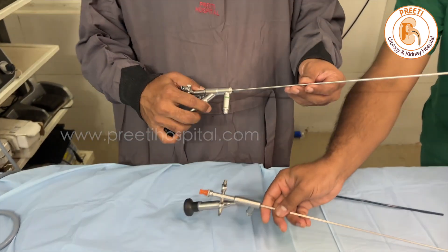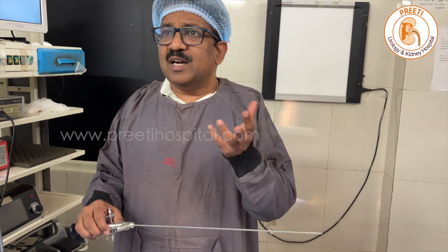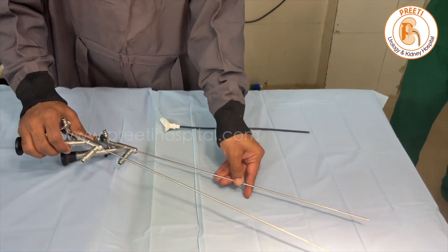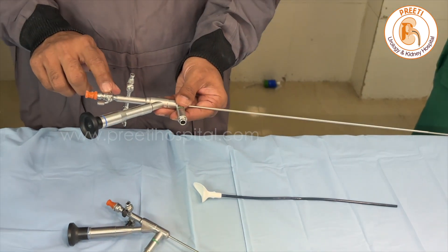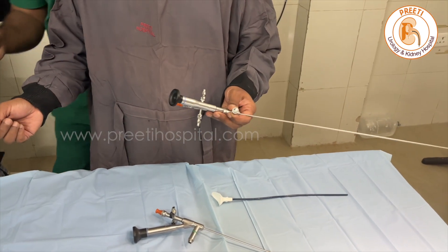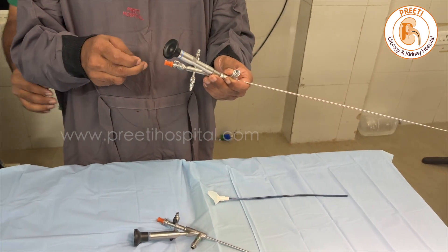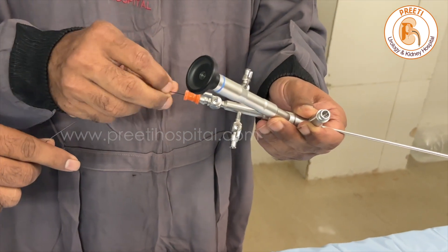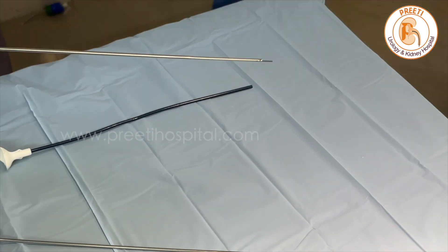But now a new scope has been released recently — this is from Biorad. There is no conflict of interest; it is only information that we have one more scope. This is slender than the Wolf. The tip is slender, and vision is good. They mention it has a 3 French channel. In this, the only difference is the rod doesn't go but the guide wire goes — a 0.025 guide wire — meaning you can pass the guide wire and keep your scope safe over the guide wire whenever you are travelling the ureter. This is actually a smaller scope.